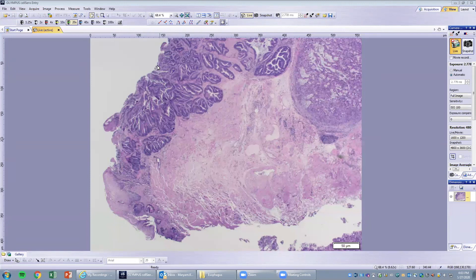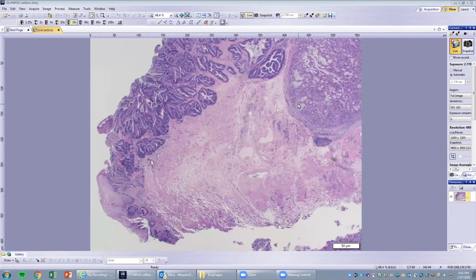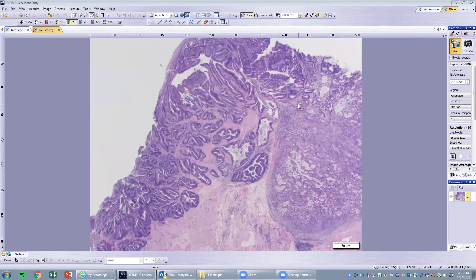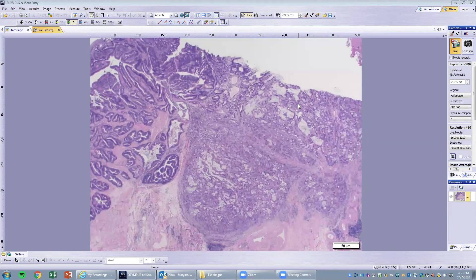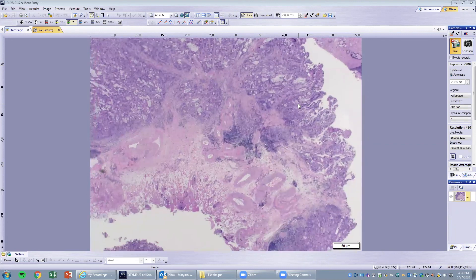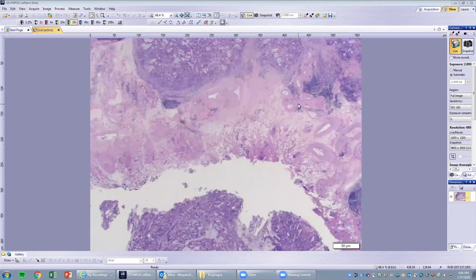Moving around, you can see Barrett's esophagus with high-grade dysplasia and invasive cancer. There is high-grade dysplasia and cancer originating from Barrett's esophagus invading. However, in this case, the lesion has already been excised.